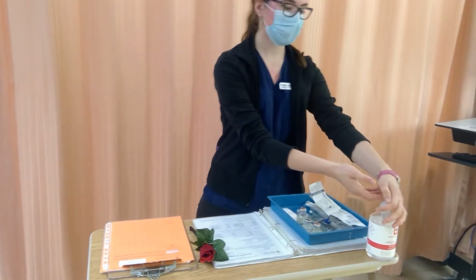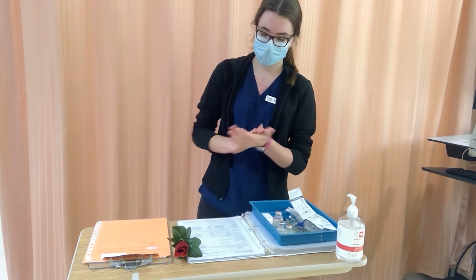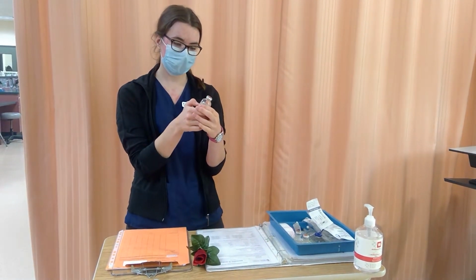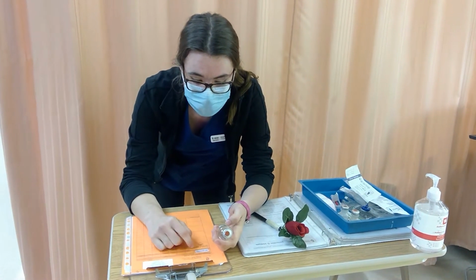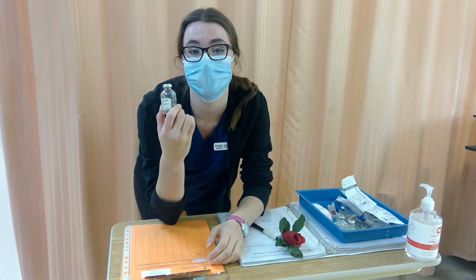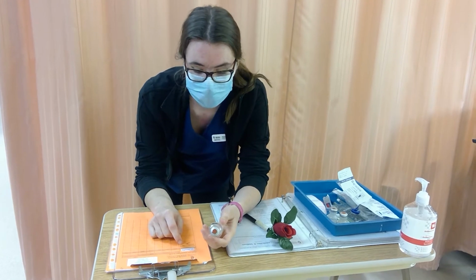Now that I've done that, I'm going to do hand hygiene. And I'm going to select out my correct medication, which is penicillin G sodium. I'm going to start by doing my first check. Correct patient is verbalized. Correct drug is penicillin G. Correct dose is 2.5 million units. There's 5 million units in here, so we're going to draw half of what we reconstituted. Correct route, it's given IV.